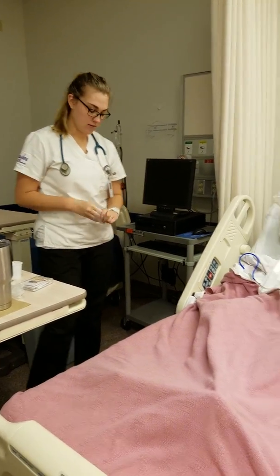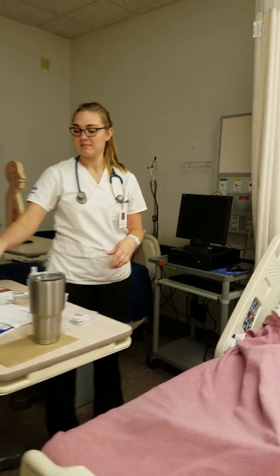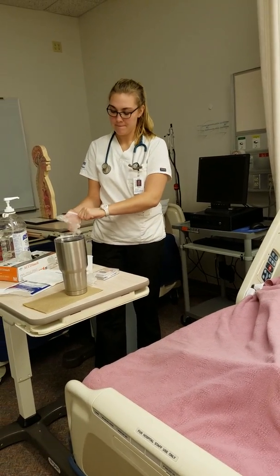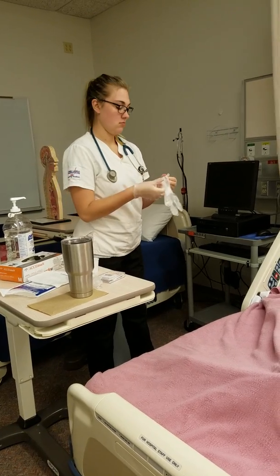And then now I'm going to take my gloves off. I would perform hand hygiene again.